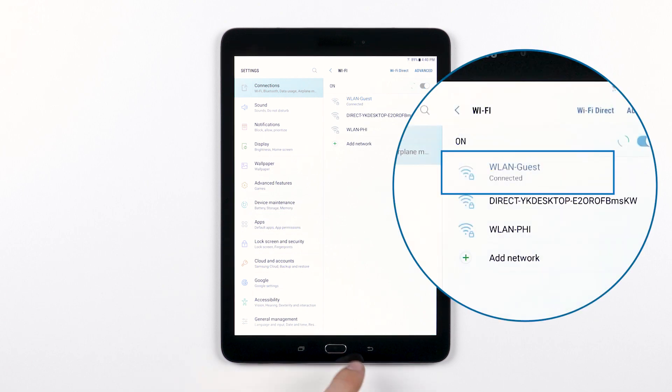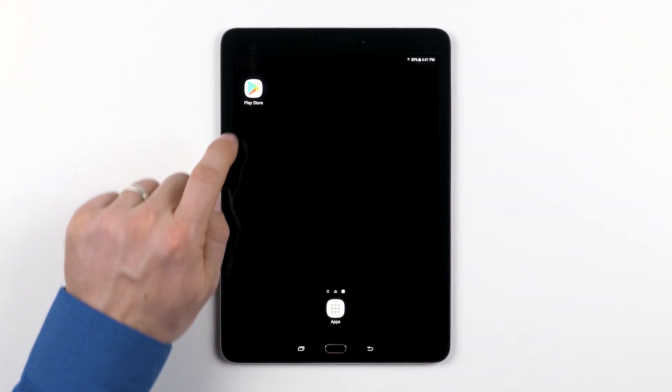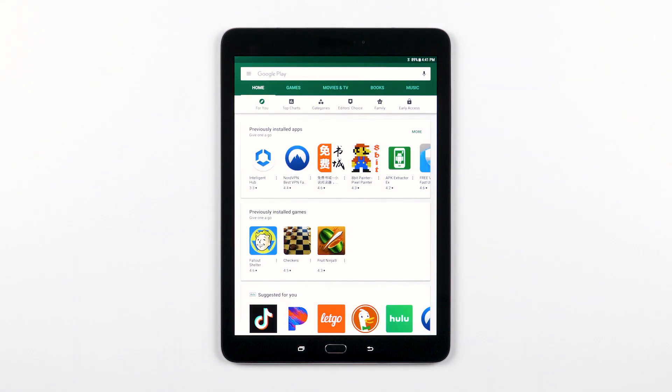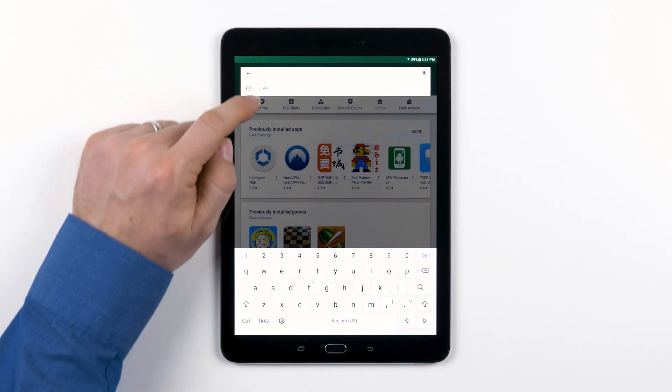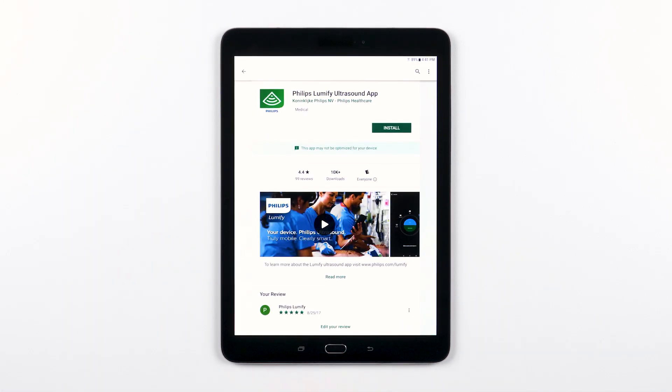Once you are connected, go ahead and open the App Store. This is an Android device, so let's open the Google Play Store. Search for Philips Lumify, and once it pops up, tap Install.